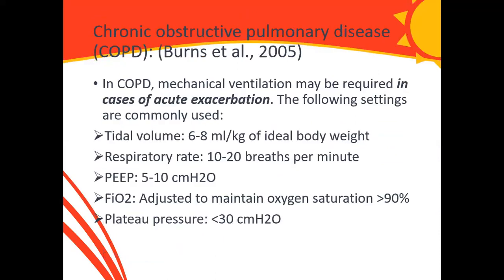In chronic obstructive airway disease, the important thing is that mechanical ventilation may be required in cases of acute exacerbation. Most times, COPD can be safely managed with non-invasive ventilation.